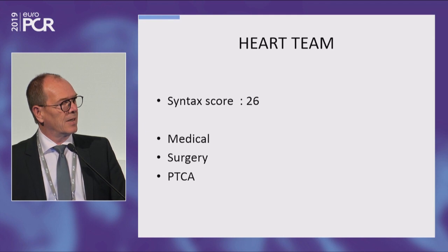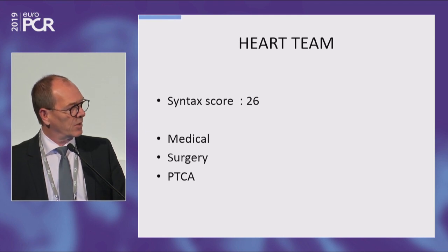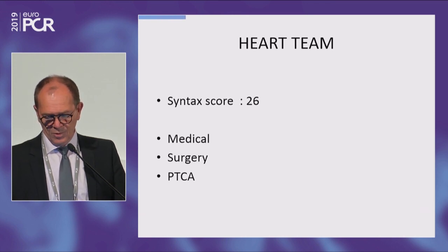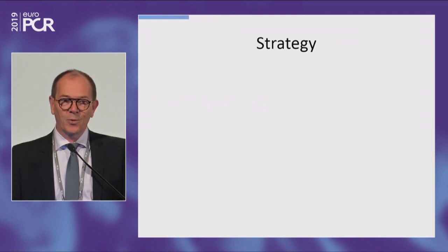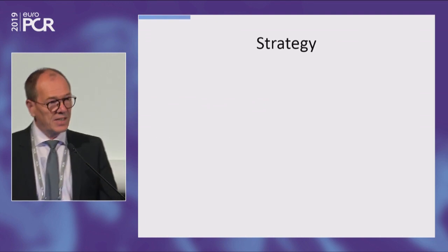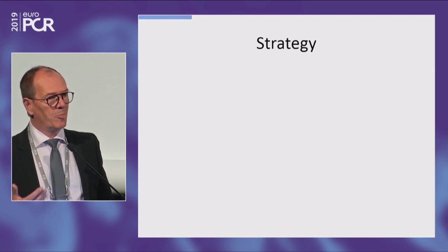to this guy. Severe risk factor, complex lesion, what kind of strategy, and because we don't have a lot of time, let's go directly to PTCA because surgeons say, no, I don't want to touch this guy. We discuss about the strategy, and this is quite important.